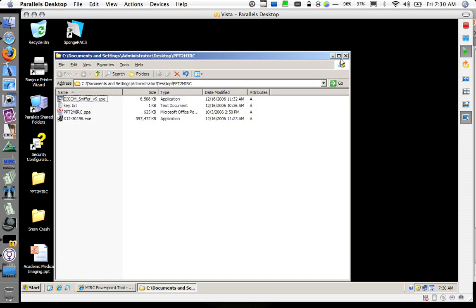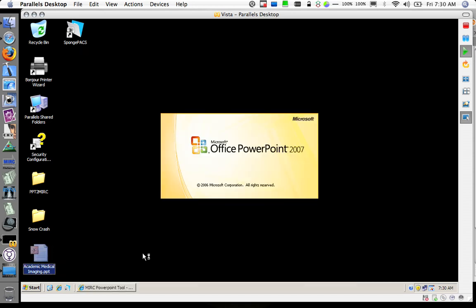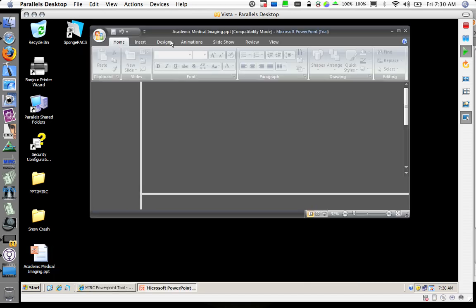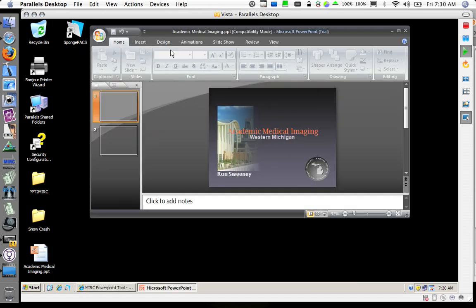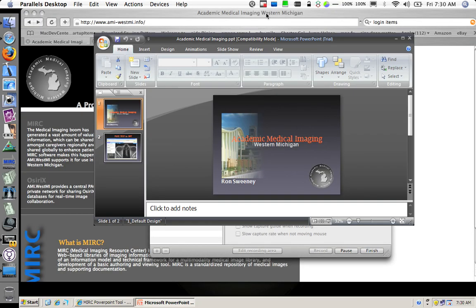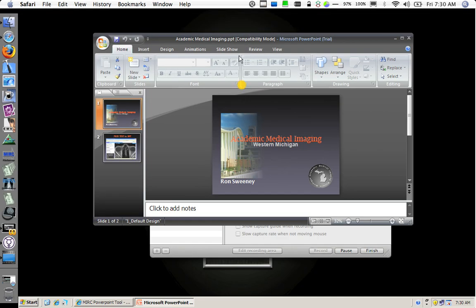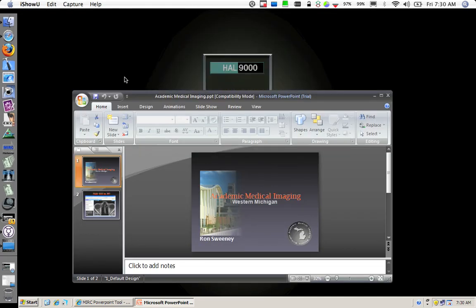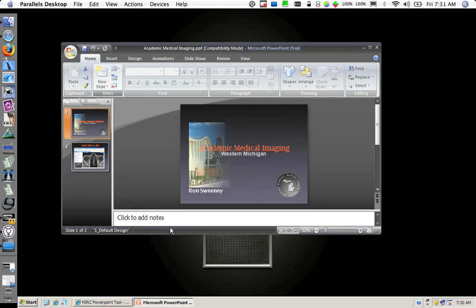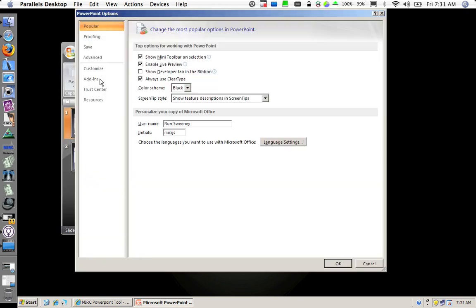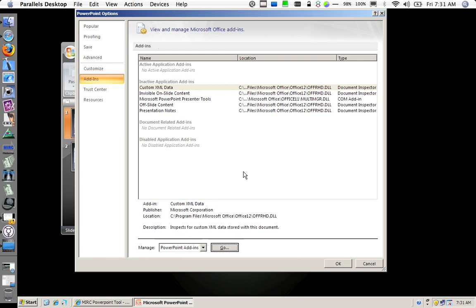I am now going to open up a small PowerPoint presentation here and install the plugin. So here is Microsoft PowerPoint. I am going to go to PowerPoint options, go over to add-ins, and manage my PowerPoint add-ins.